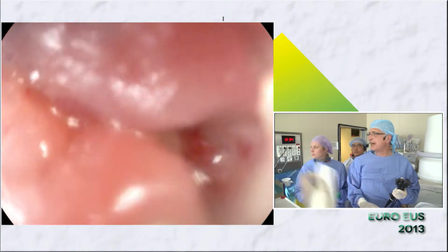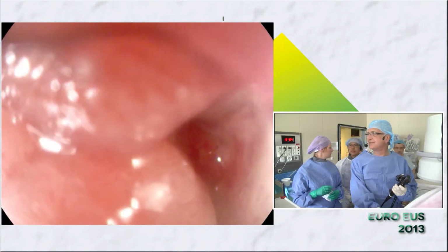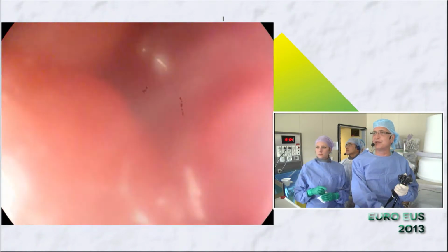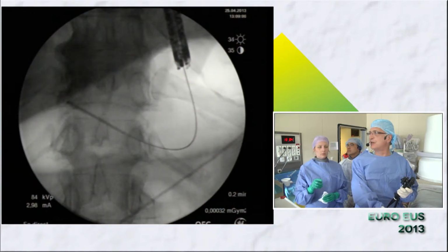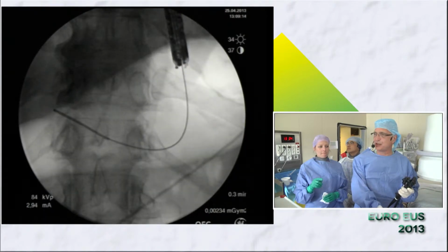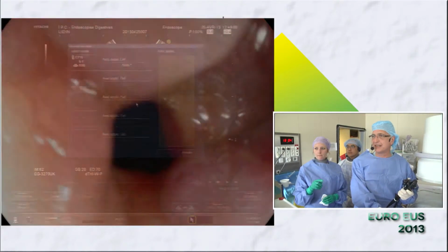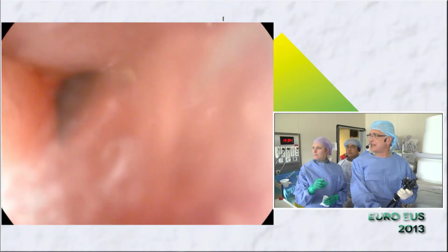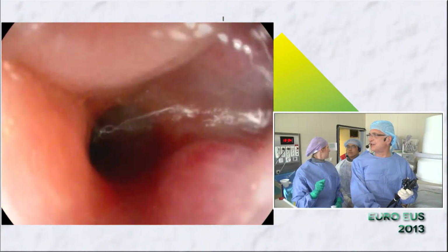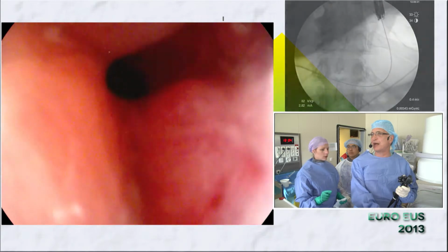So may I have a Savary guide wire? I will show you the way I put my markers. I don't need any markers. I have more anatomical markers. Fluoro please. And you see I asked Steph to take a picture at this level. Then I know that the distal end of my stent should be just at this level, probably not really below, because you see that here we have the tumoral infiltration which starts, but I do not want the stent to be really deeply inside the stomach, because otherwise the risk of migration is quite high.